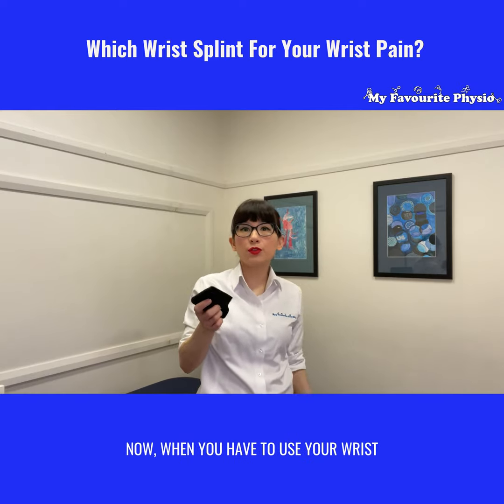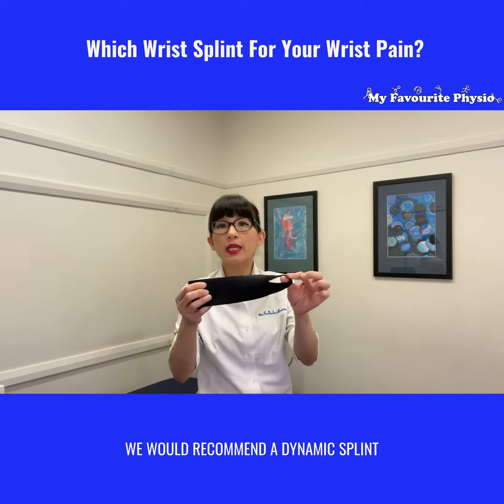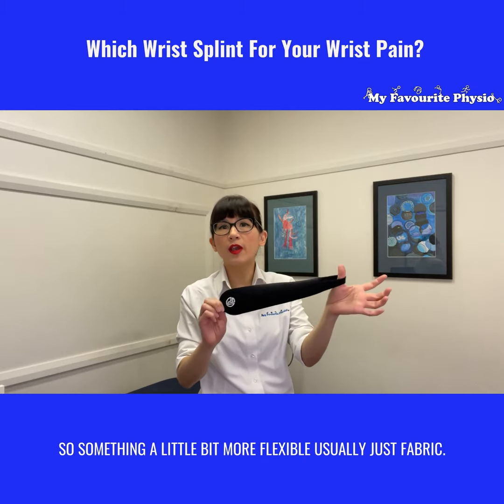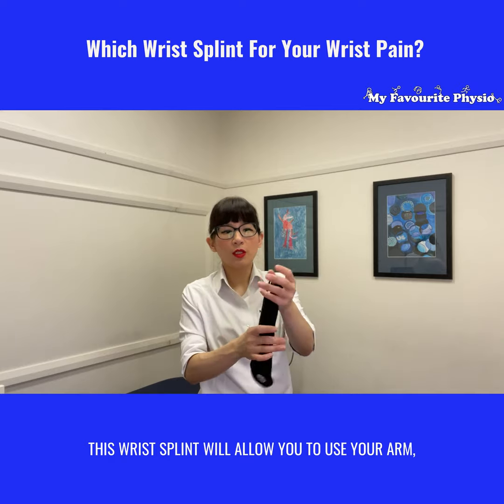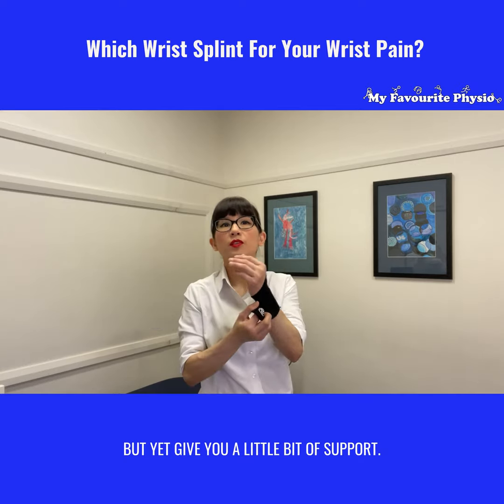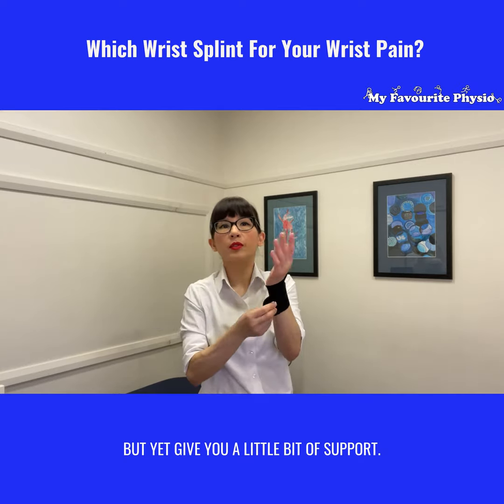Now, when you have to use your wrist, we would recommend a dynamic splint. So something a little bit more flexible, usually just fabric. This wrist splint will allow you to use your arm, but yet give your wrist a little bit of support. So it is flexible. It allows you to use your hand, but gives you that support like someone's holding your wrist as you move about.